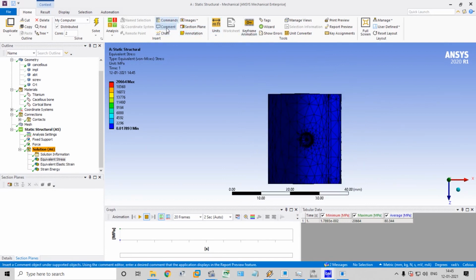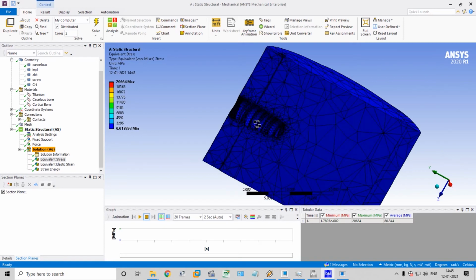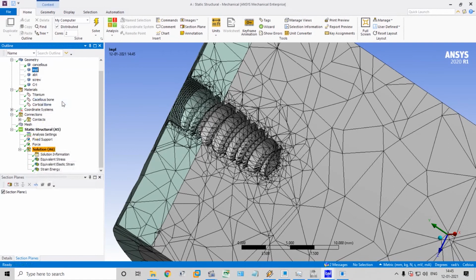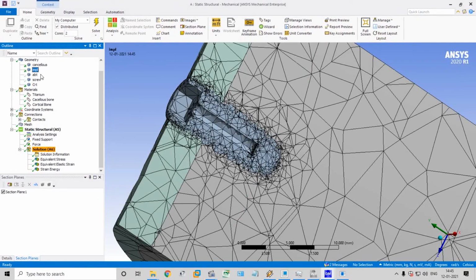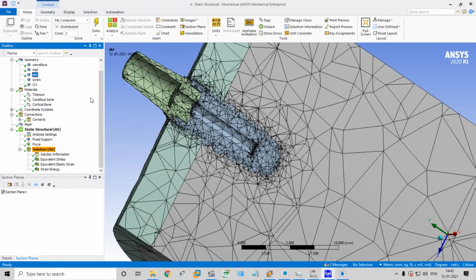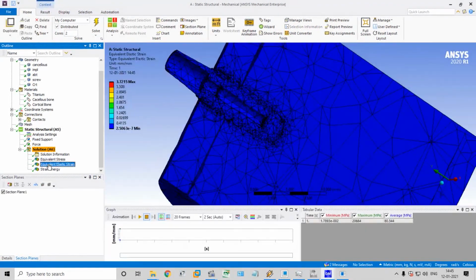Here, click this. Here we can split into half, and we can see inside the cavity with the bone, the drilled space. We can see the cavity. Now show body. The implant will be halfly split. Abutment, show, screw, wherever we can see.